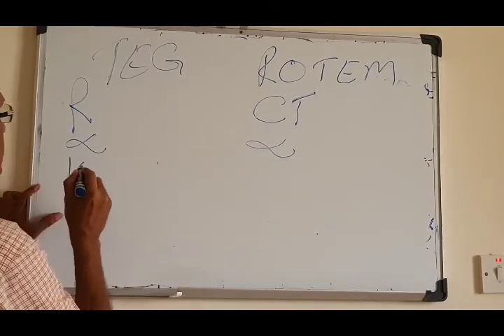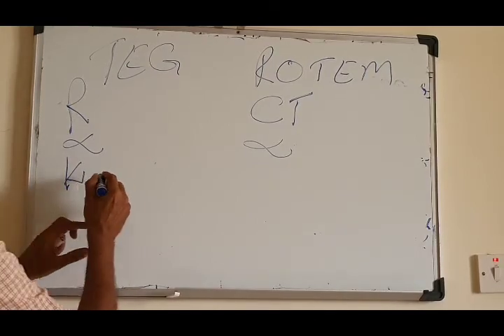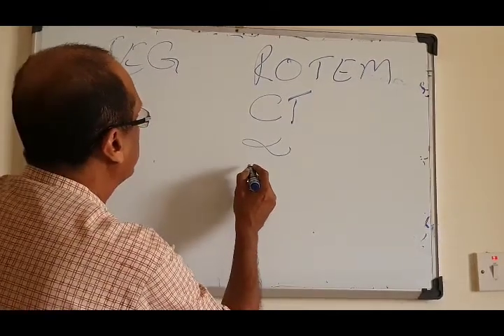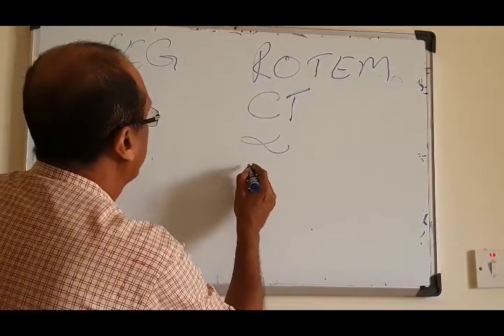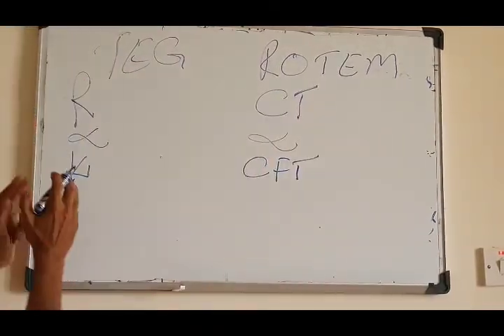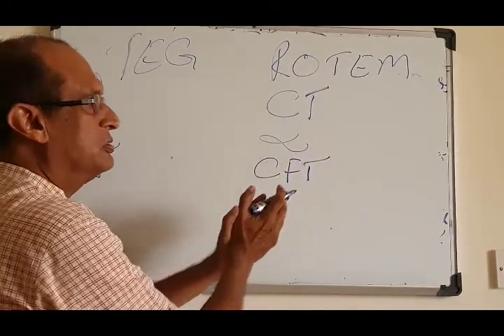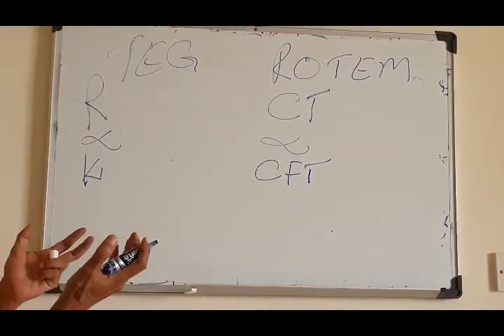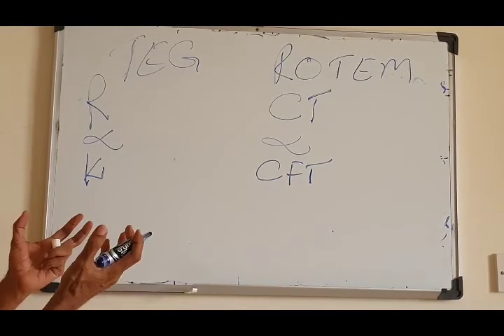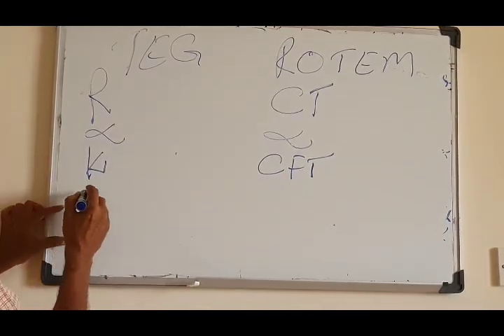Kinetic time is the fibrin generation, that is replaced in ROTEM by the clot formation time. So if the kinetic time is prolonged or the clot formation time in ROTEM is prolonged, you know again that there is deficiency of the fibrinogen or fibrinogen functional abnormality. You have to replace the fibrinogen.